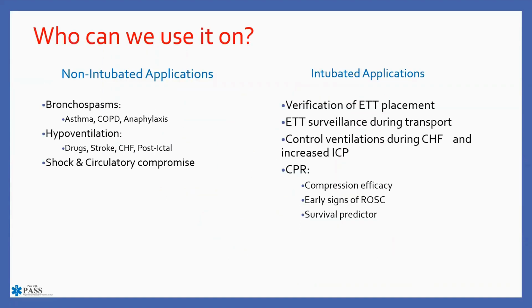So who can we use it on? Intubated and non-intubated applications. Let me get through here, and then we'll take a quick break before we look at the actual waveforms. In your non-intubated patients: bronchospasm, asthma, COPD, anaphylaxis. Remember, with bronchospasm, your asthma and COPD patients, the problem is getting air out. It is not an inhalation issue. It is actually an exhalation issue, and that is where the problem comes in and what we will be able to see when we look at capnography.